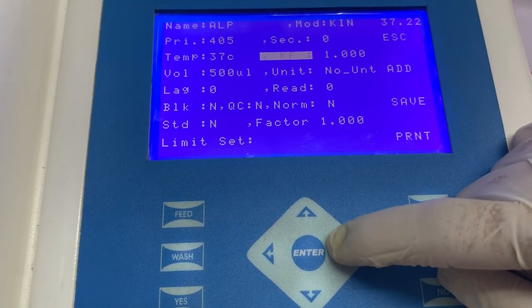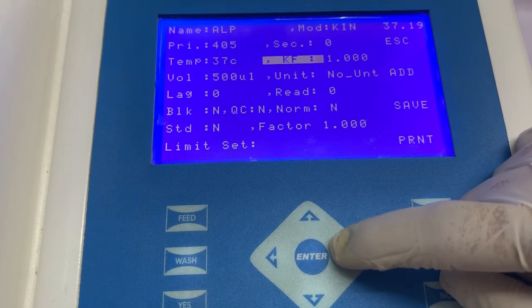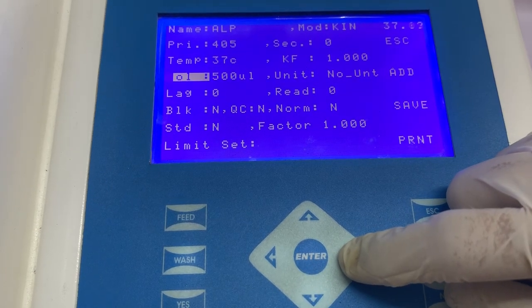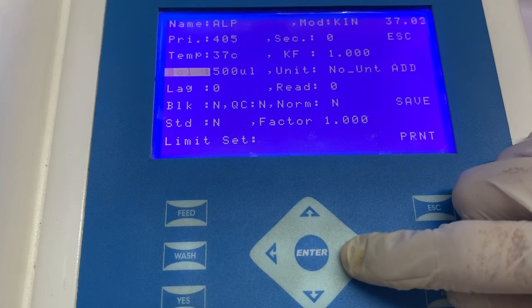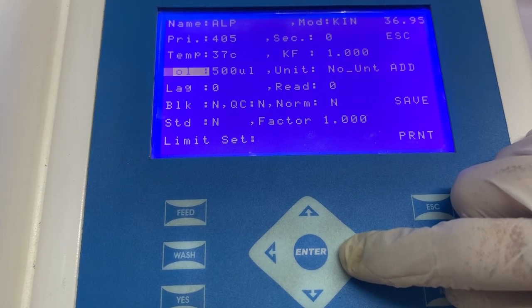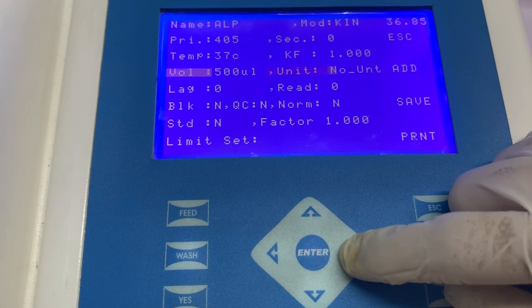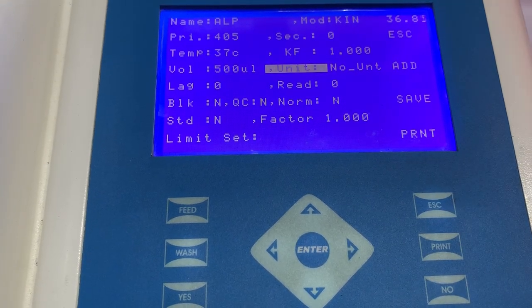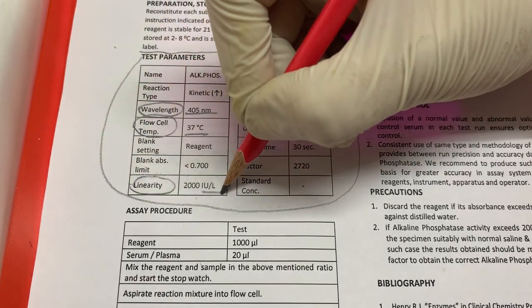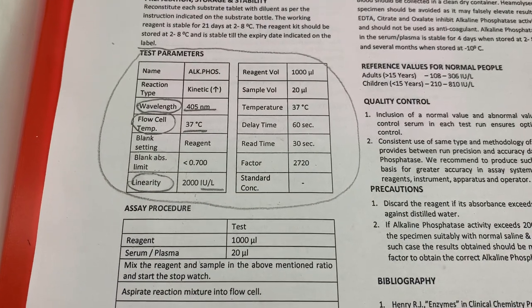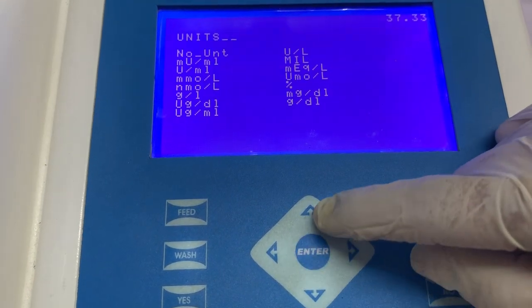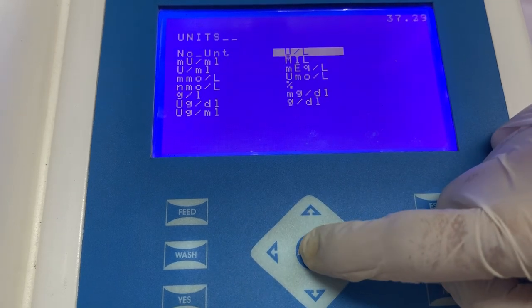The next information that needs to be added is of KF or kinetic factor, which is to be maintained at 1.0. The next information to be added is of volume or aspiration volume. Aspiration volume can be maintained at 500 microliters, or if you are doing the entire test in 500 microliters, the aspiration volume can be reduced to 400 microliters. The next information that needs to be added is of unit. To check what unit to enter, refer to the linearity column in the instructions for use — whatever unit is mentioned in the linearity, the same unit we have to enter into the software. Select the option of unit and from the list choose the unit mentioned in the instructions for use.